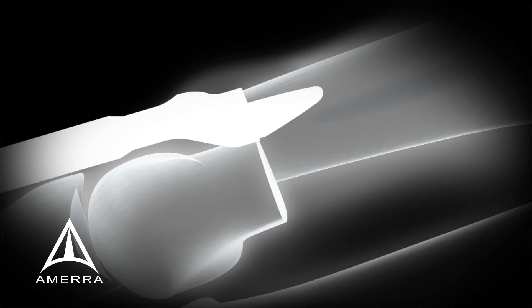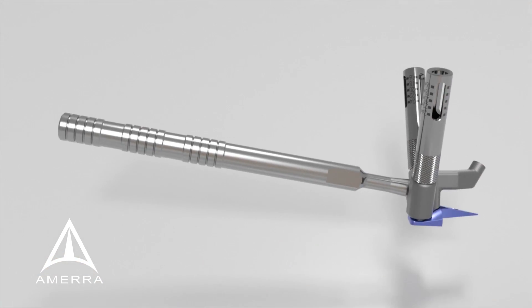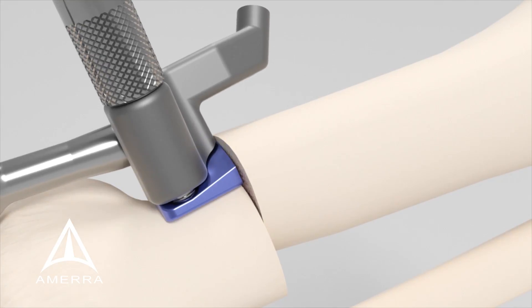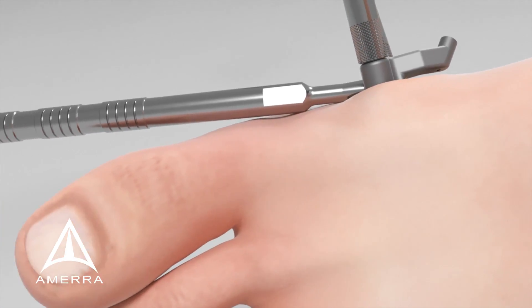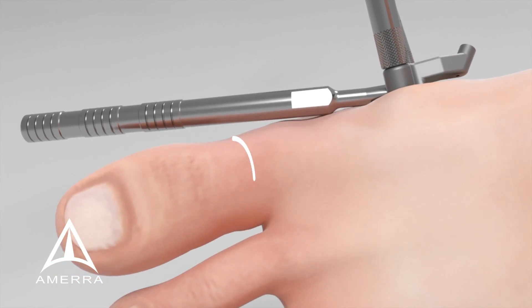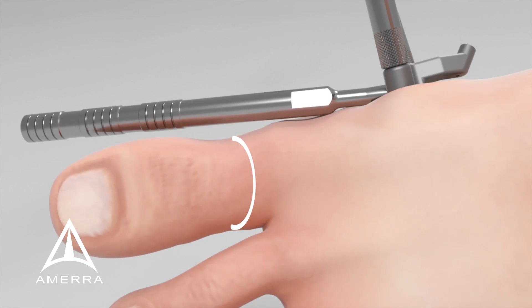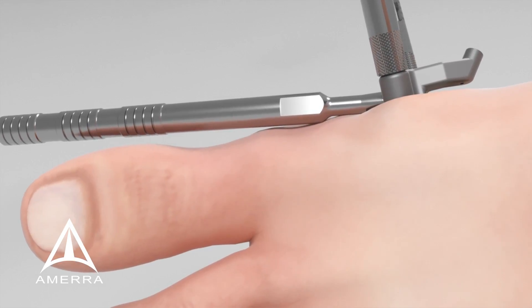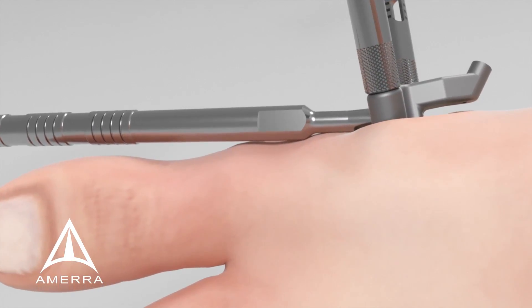Remove the broach and using the plate placement guide assembly, insert the MIB plate into the broached region. The distal segment should be over-rotated for varus correction to ensure proper repositioning of the sesamoids below the metatarsal head. This is a key feature to the procedure as it ensures proper correction of the sesamoids and deformity.